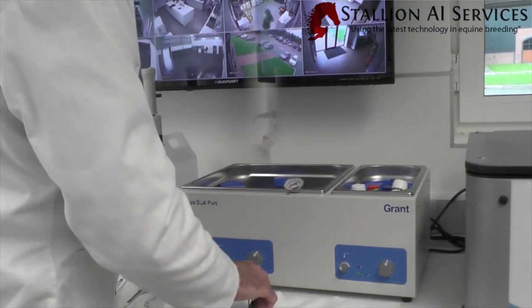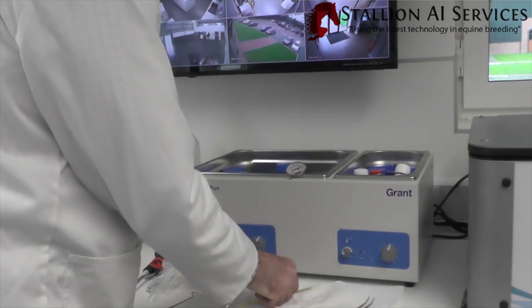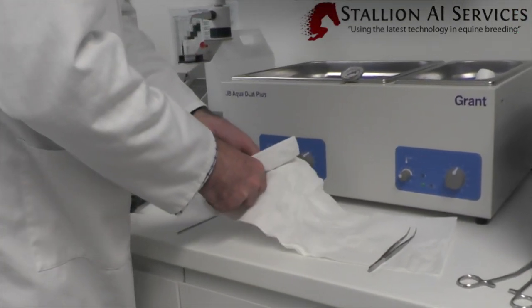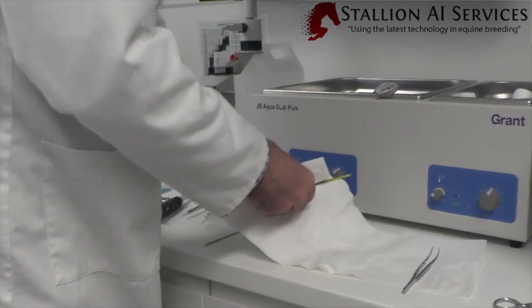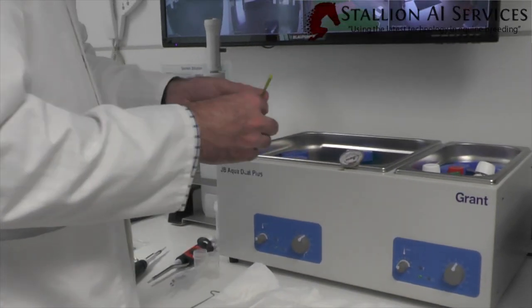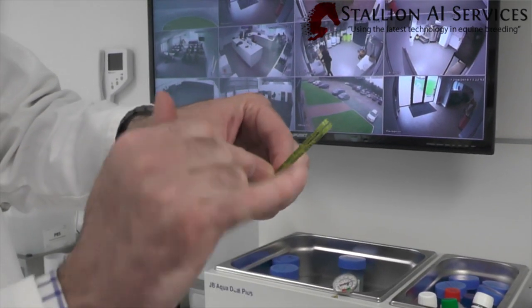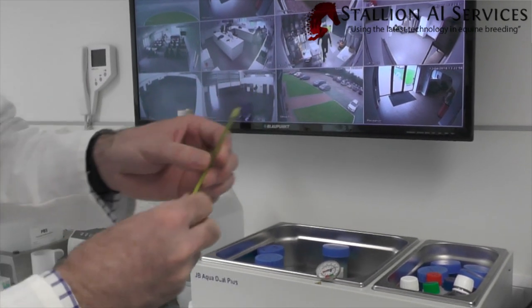After its 30 seconds in the water bath we take the straws out, and the importance with frozen semen once you've thawed it out is to make sure they're dried off really, really well. Any water contamination is going to have a detrimental effect straight away to the semen. So we dry the straws off to get rid of the water. The straws are sealed at one end with a cotton bung, and at the other end they're sealed with a crimp — and this is the end we've got to cut off initially.